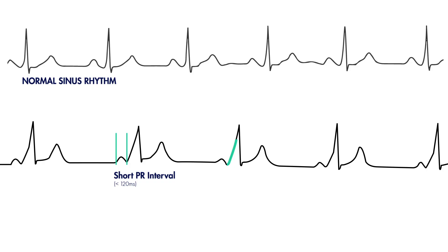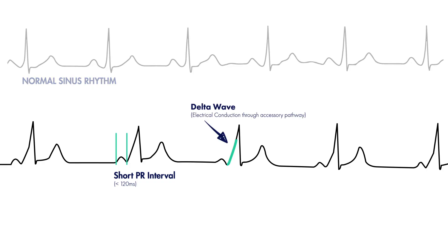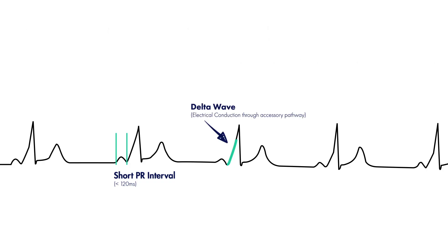This is referred to as a delta wave. Notice how this precedes the actual QRS complex. The delta wave represents earlier electrical activity through the accessory pathway, and the QRS complex represents electrical conduction that still passes normally through the AV node.